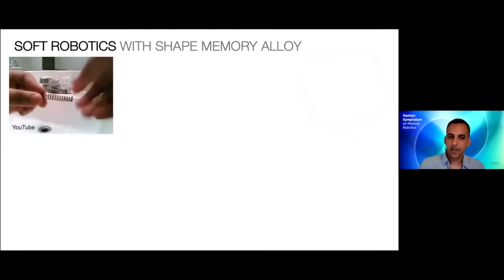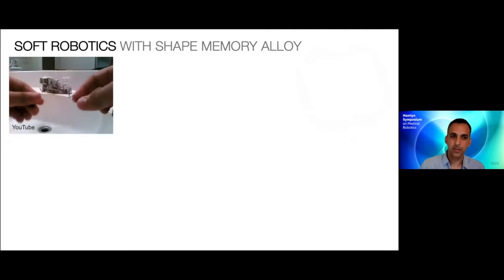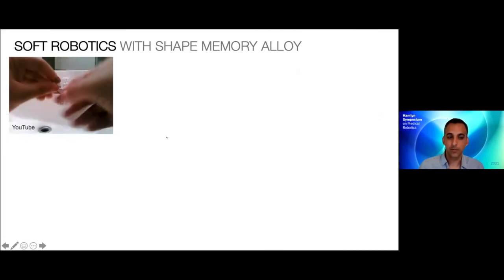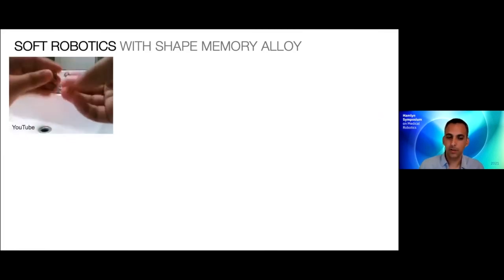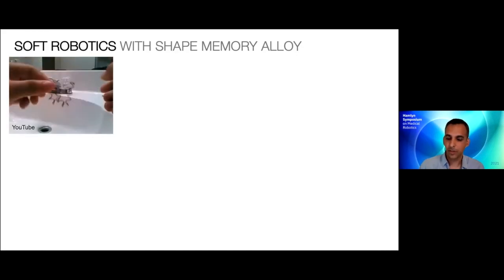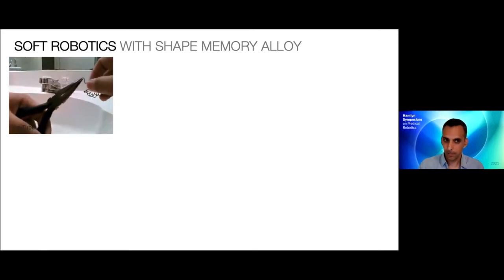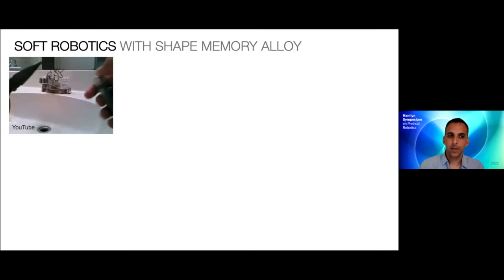Like I said, a lot of our focus has been on applying these soft skins to soft robot grippers. The way that we actuate these grippers is using shape memory alloy. This video that I took from YouTube shows a very commonly used shape memory alloy called nitinol, a nickel titanium alloy that at room temperature is very compliant, highly deformable and malleable. But when you heat it up, either with external heat or by passing electrical current through it, it recovers its shape. It becomes much stiffer and goes back to its original geometry, which in this case was this coil. This is the principle that we're leveraging.